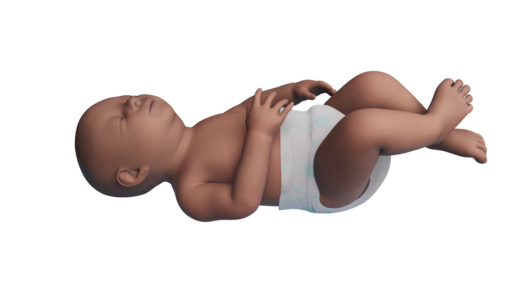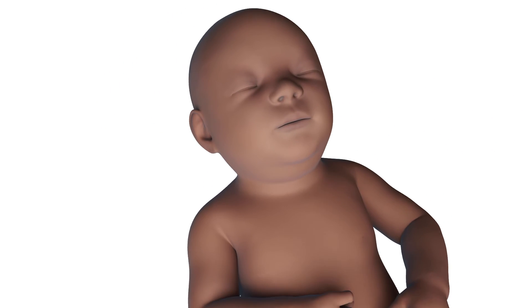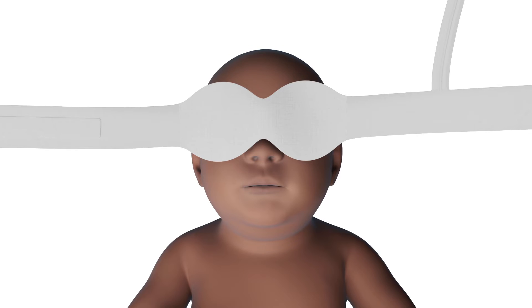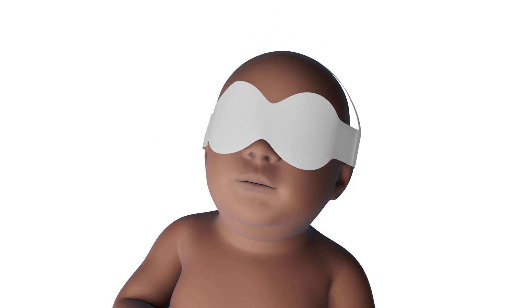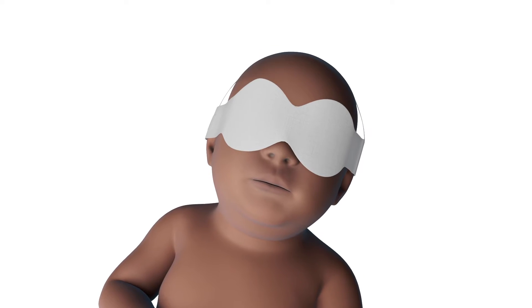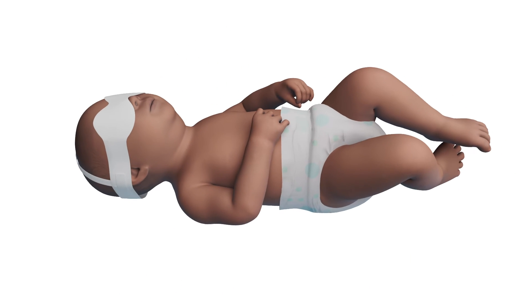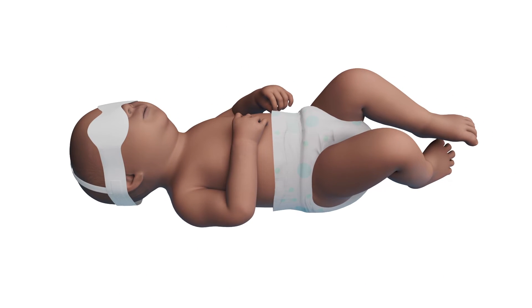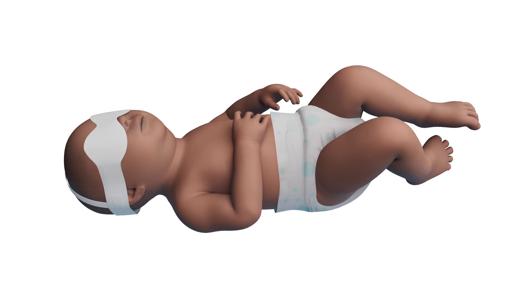We will now show you how to prepare the baby for phototherapy. Before starting treatment, always shield the baby's eyes with a protective eye mask designed for use during phototherapy. You may remove the eye protection when caring for the baby outside of the phototherapy area. The baby should only be wearing a diaper during phototherapy treatment. For the treatment to be effective, the light must shine directly on the baby's skin.